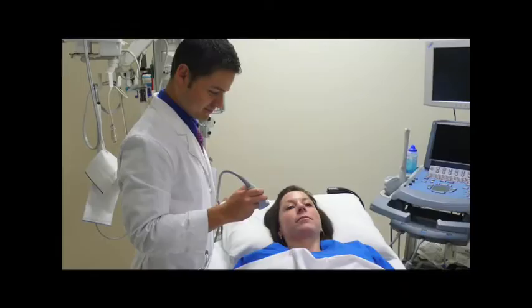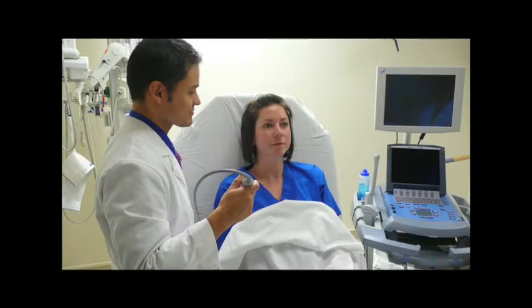Floating the ultrasound probe over the suspected eye on a layer of sterile ultrasound gel is recommended in order not to apply any pressure to the globe itself. Ocular ultrasound may be performed on a patient in the supine or upright position. Once a comfortable position is found for the patient, it is wise to do the same for yourself, whether it be in the standing or sitting position. We will now be demonstrating how to perform an ocular ultrasound exam.